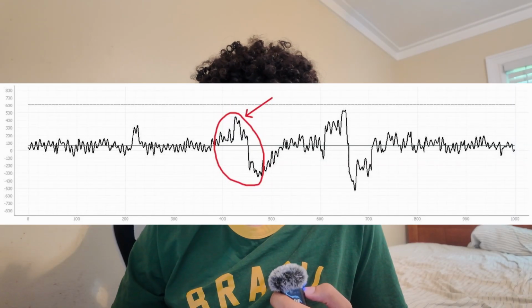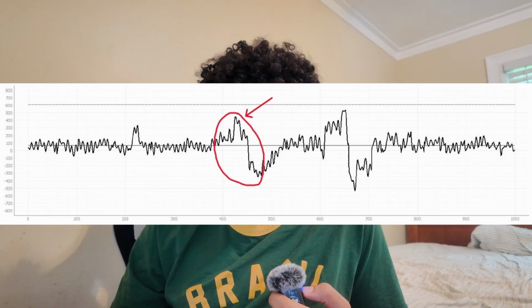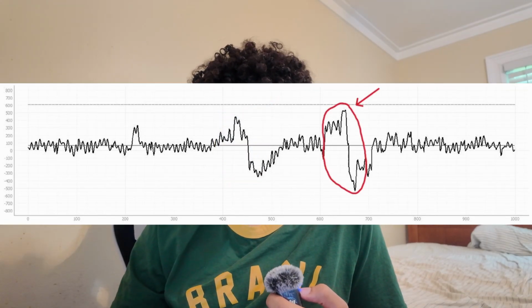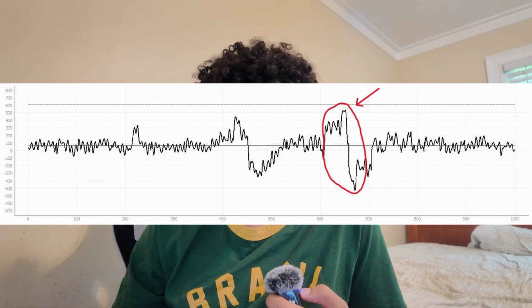So the finger uses an attention-based spike detection algorithm. In other words, it's not targeted towards when I think about moving my finger, the finger will move, but instead, it's looking for sudden changes or spikes in brain activity. So the finger can open or close while doing literally anything. Take a look at this picture on screen. This is an image of an EEG or brainwave signal. The program can't necessarily differentiate between this spike being close the finger or this spike being brush my teeth.